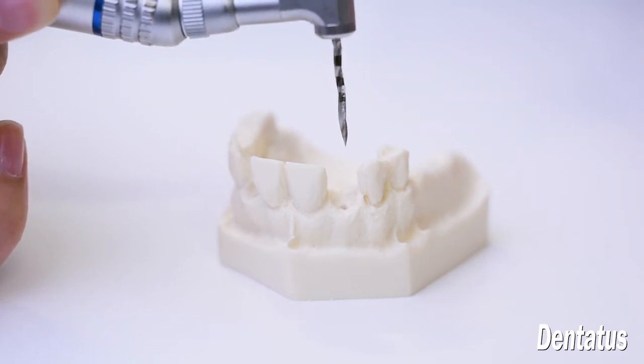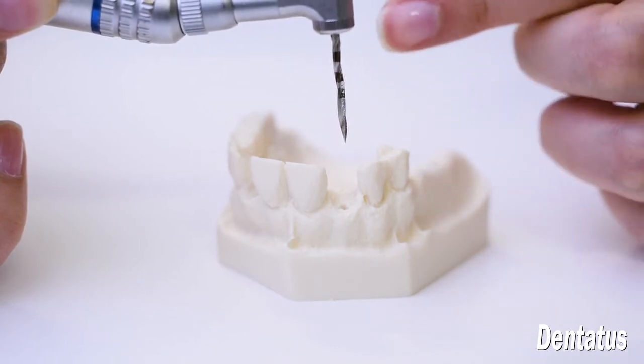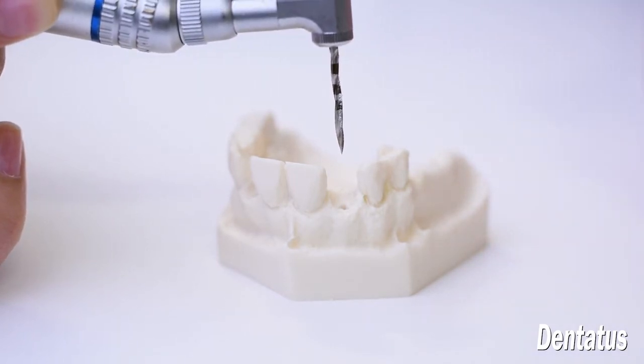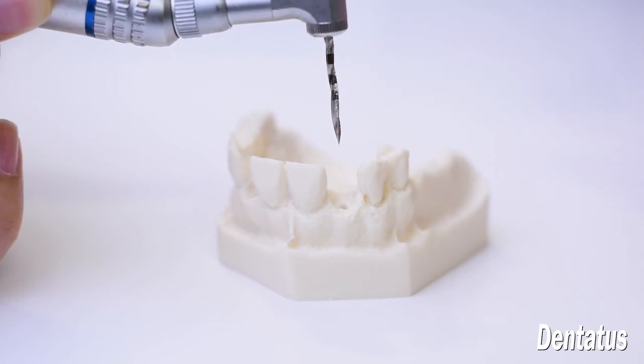The static piercing of the tissue, in addition to the fluted design, prevents epithelial entrapment and eliminates the need for a tissue punch. The SEPO 1.8 mm pilot drill is operated at 1300 to 1500 RPM with copious irrigation.